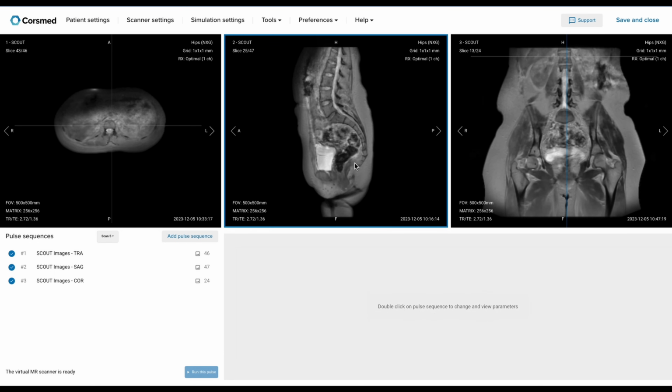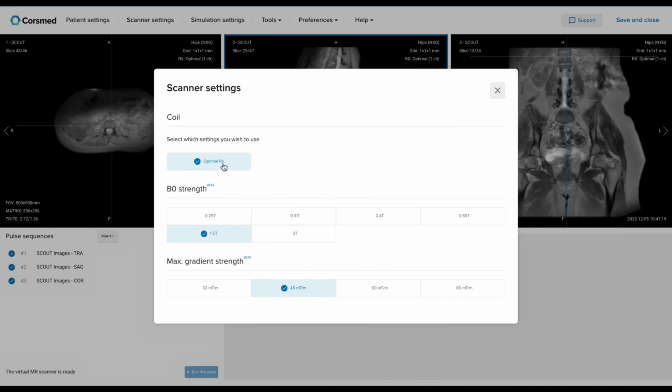When positioning the patient, we'll place them supine on their back and center the scanner's lasers in the middle of the coil, positioned on the lower abdomen. You can touch the coil's upper border with the patient's iliac crest. That will mark your upper limit. For the coil, we want to choose a pelvic or body-phased array coil. This type of coil improves resolution and signal-to-noise ratio for deep tissue structures.